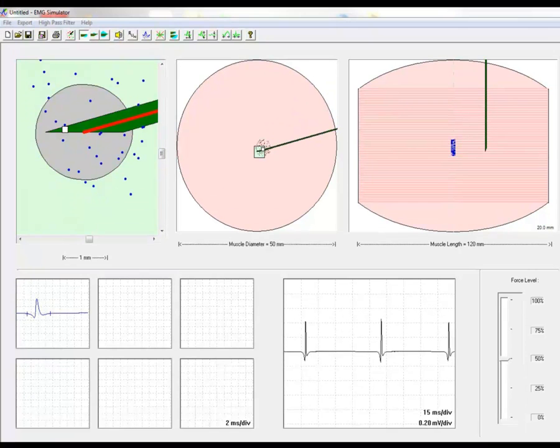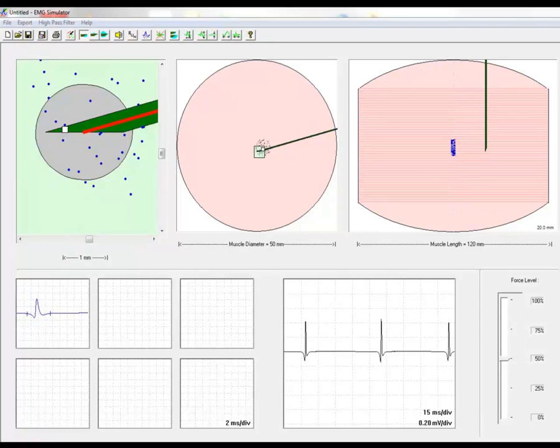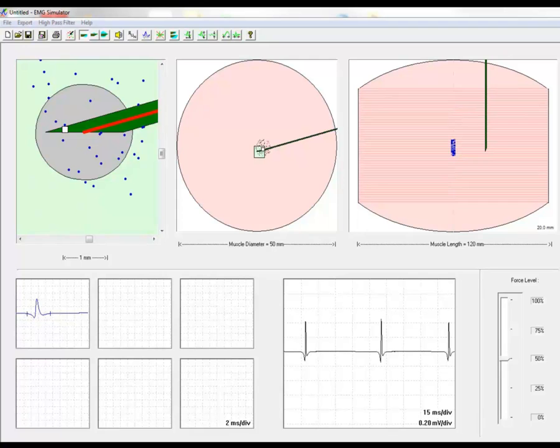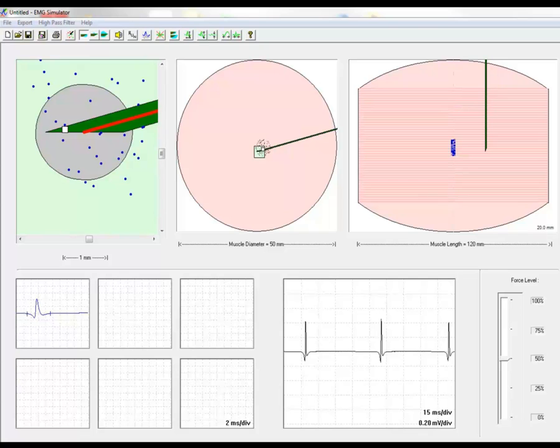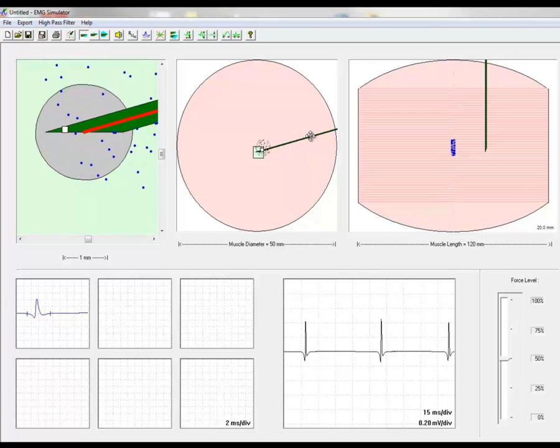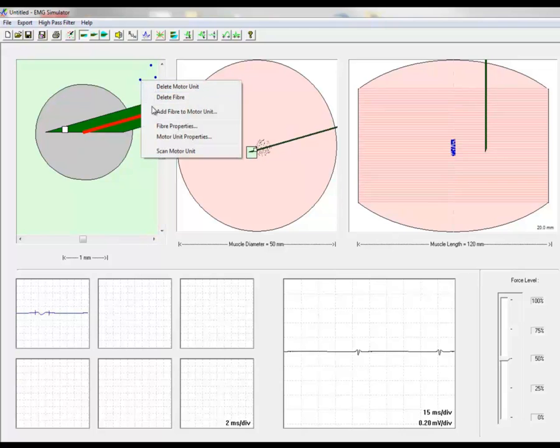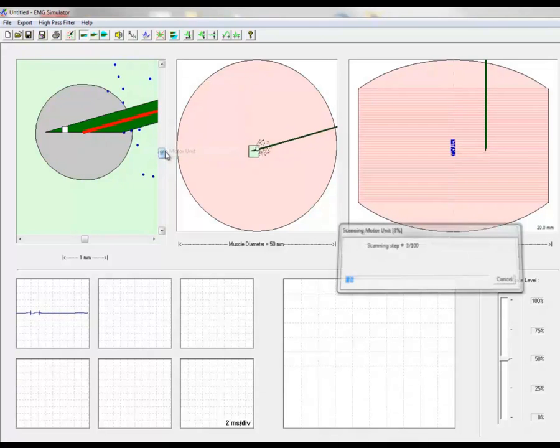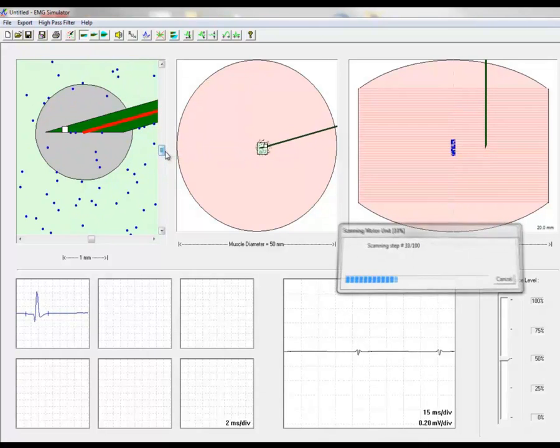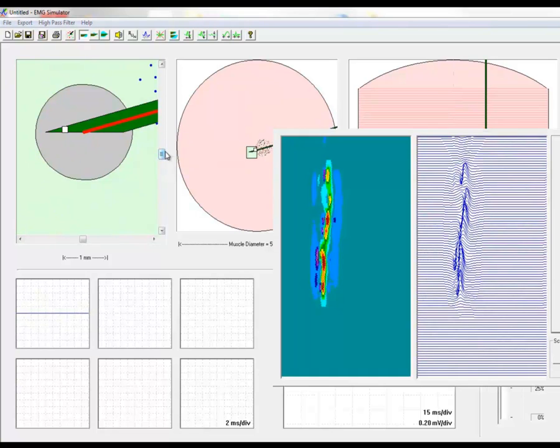Now I am going to show the electrical cross section of a motor unit by means of the so-called scanning EMG. Normally we have a little motor connected to the electrode that retracts the electrode in 50 micron steps after each discharge. This is not used in routine but it is used to understand the topography of the motor unit. Here the electrode is pushed to the other side of the motor unit and we start the scanning. In this simulator it goes very quickly and you see here how the electrode is pulled and we obtain the signals from different places in the motor unit.